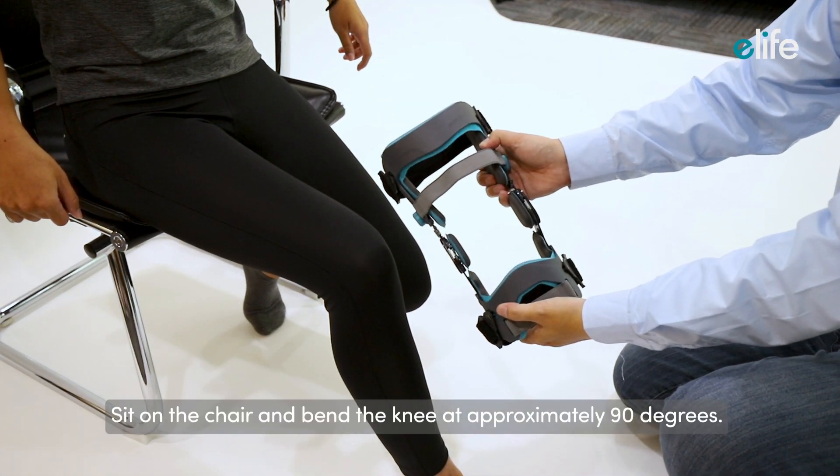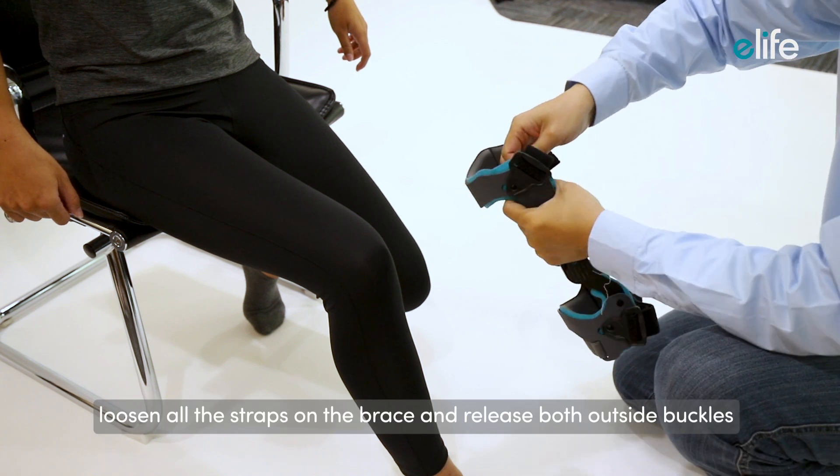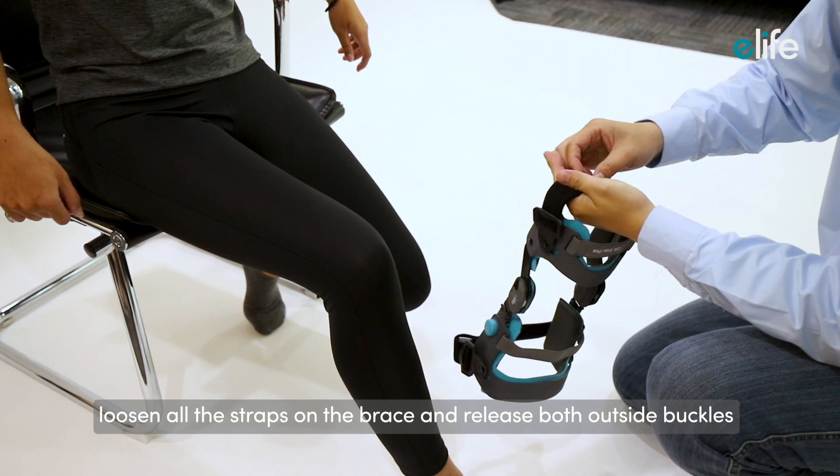Sit on the chair and bend the knee at approximately 90 degrees. Loosen all the straps on the brace and release both outside buckles.